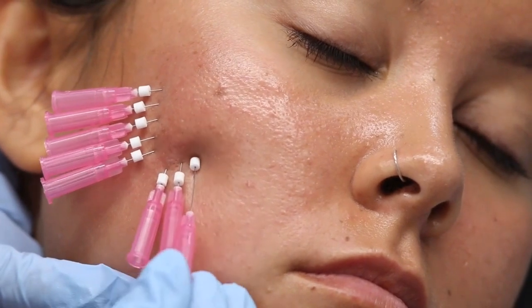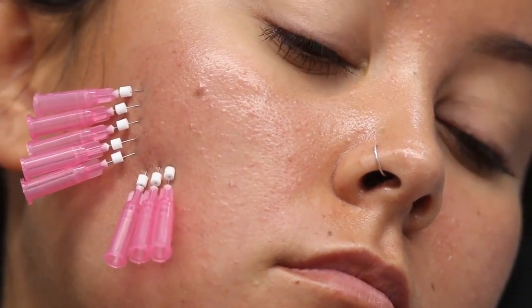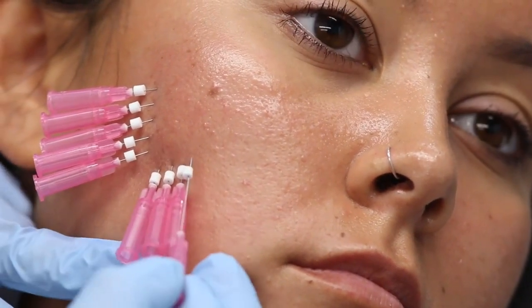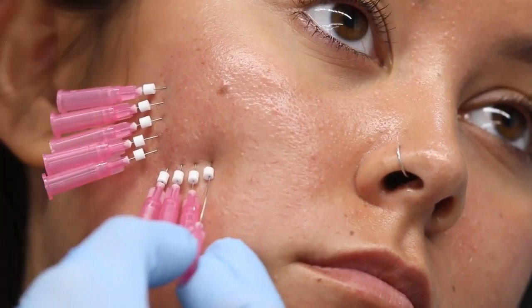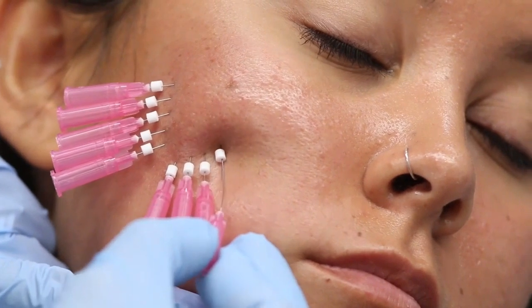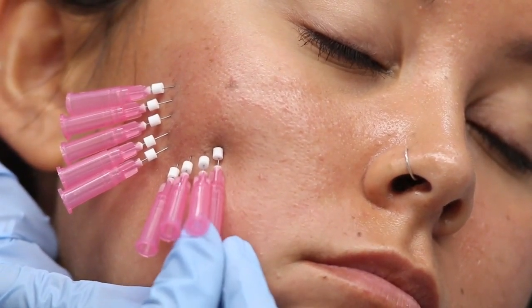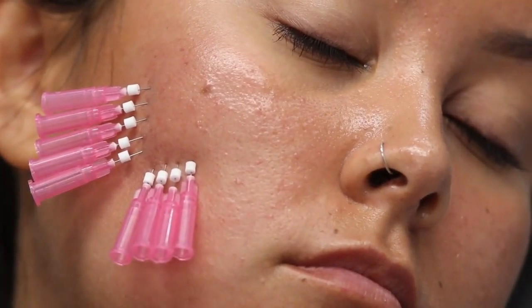And the way Ashley bends the hub, the way she accomplishes all that, and knows when to straighten out, is all about getting in the correct plane for this. And these can all go in at one time, as you see. They can all go in, or they can go in one at a time and have them taken out. It really doesn't matter. It really depends on you, the operator, for all of those things. So that is looking really good.